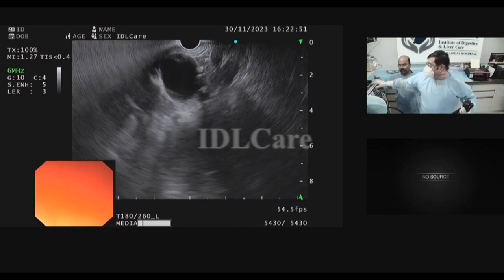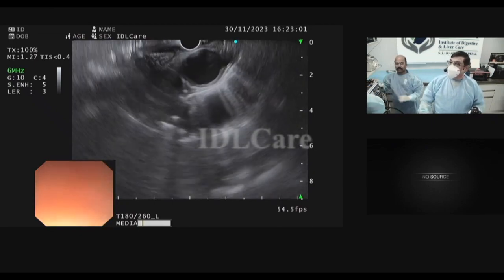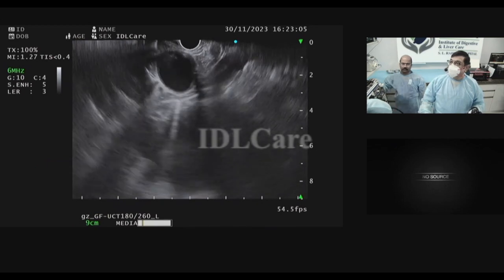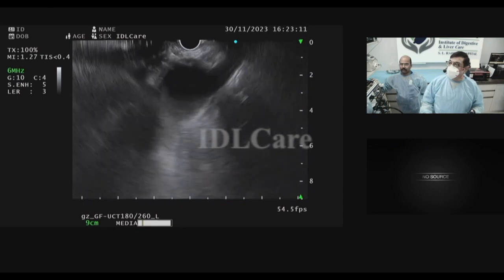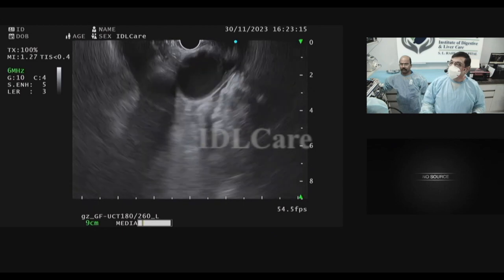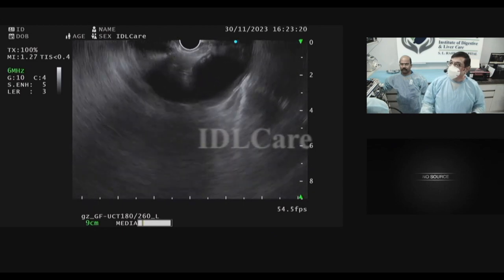And you see both the aorta and the pulmonary artery. So we are seeing the aorta and pulmonary artery here. See, this is the aorta. Come back. Yeah. Here. See this? That's a pulmonary artery. You can beautifully see the full left pulmonary artery. This is the arch of aorta. So you can see any lymph node that is there in this area very easily.